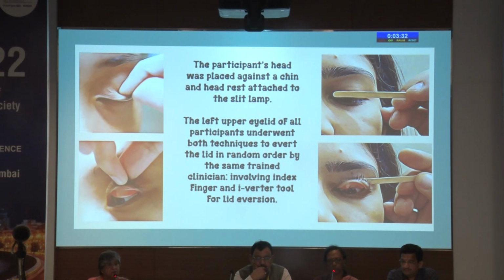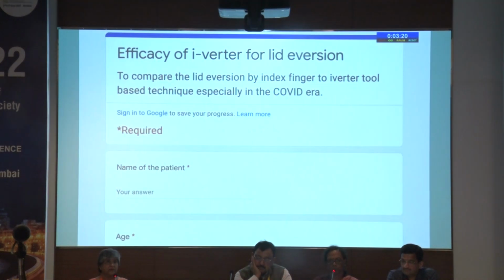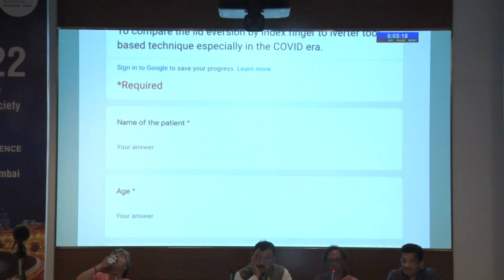The left upper eyelid of all participants underwent both the techniques to evert the lid in a random order by the same trained clinician, involving the index finger and the iVerter tool for lid eversion. A Google form was filled for the same.